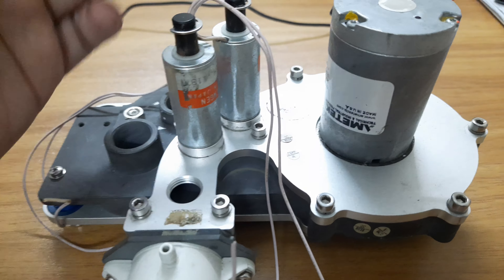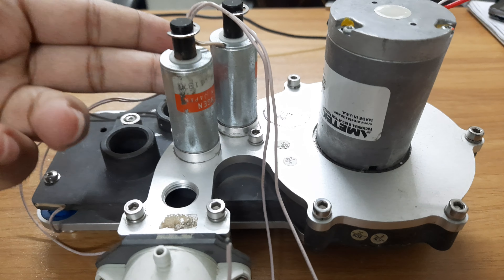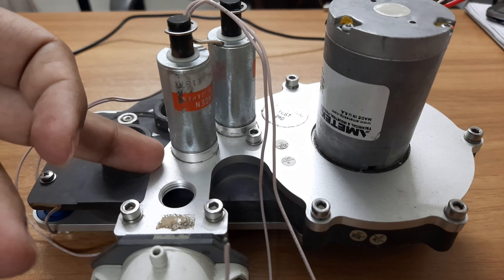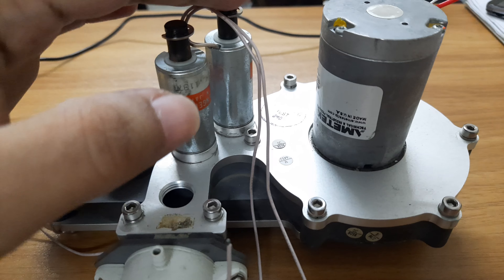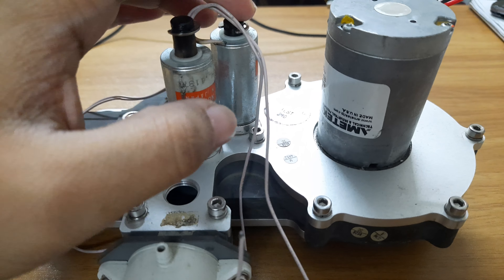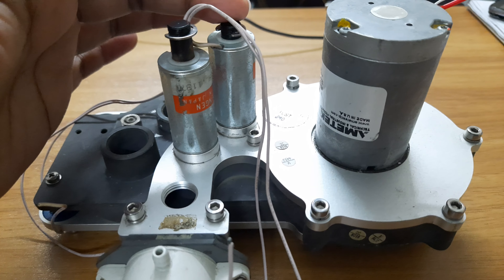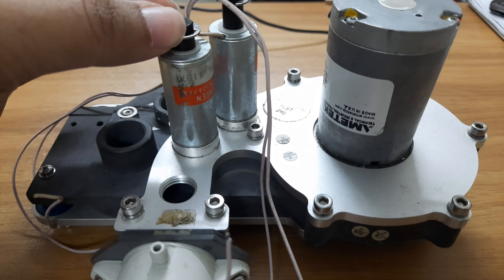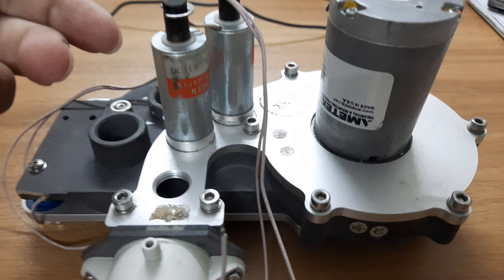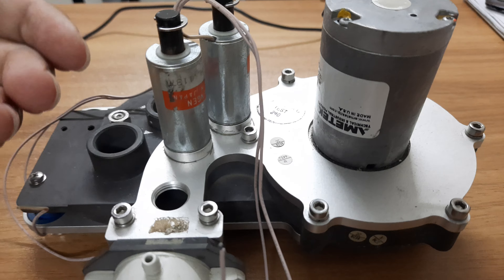Now the question is: these two solenoids look the same from the outside, but inside they are not the same — the diameter of the hole is different. Primarily, one solenoid is used to release the pressure, then if needed, the other solenoid comes into action so that you can control the pressure very precisely.